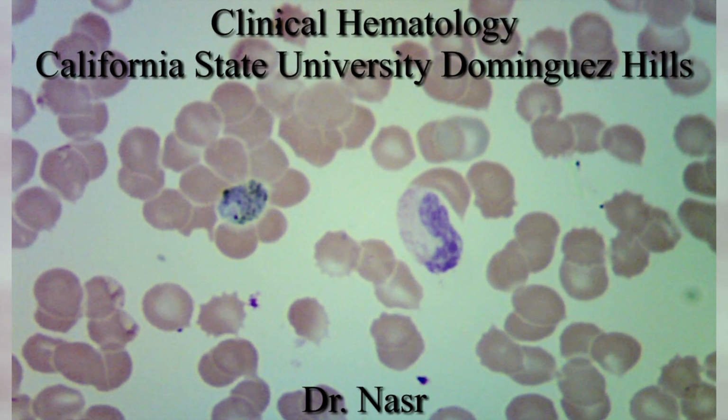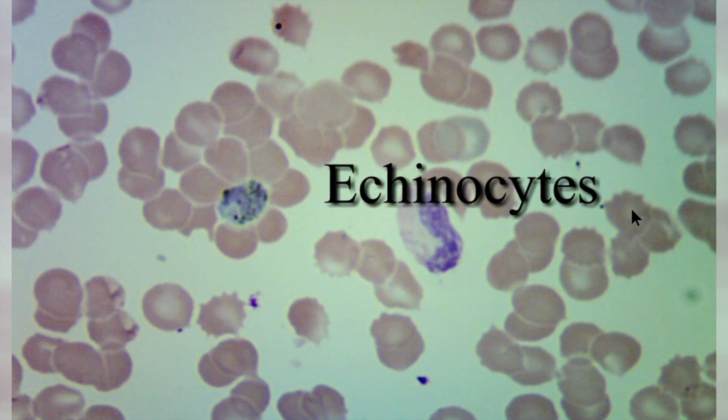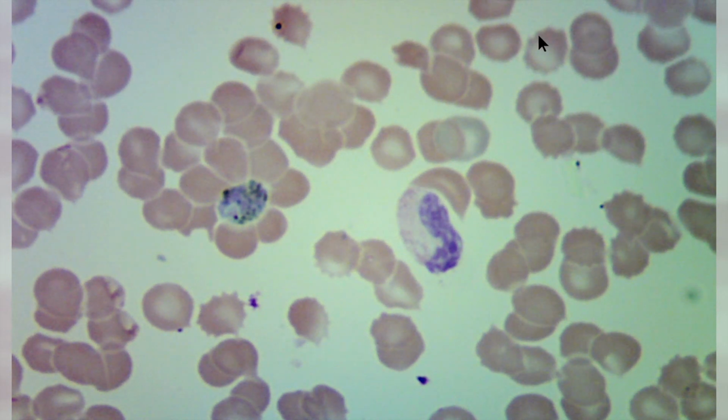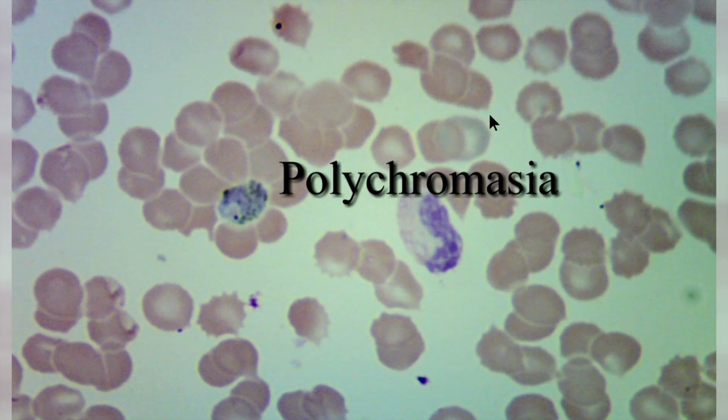Nasser, and in this clip we are going to look at the blood film and try to discover what may be abnormal in this smear. At the first glance, we do see some abnormal morphology, echinocytes, they are present here. Now, whether or not they are true echinocytes or an artifact from late slide making, we don't know that. But they are present here, and I would in this case report the echinocytes at least 1 plus or 2 plus even. There may be some target cells present, slight polychromasia.